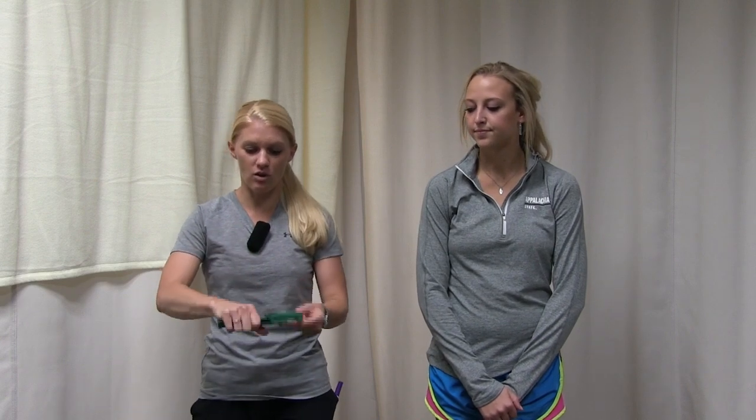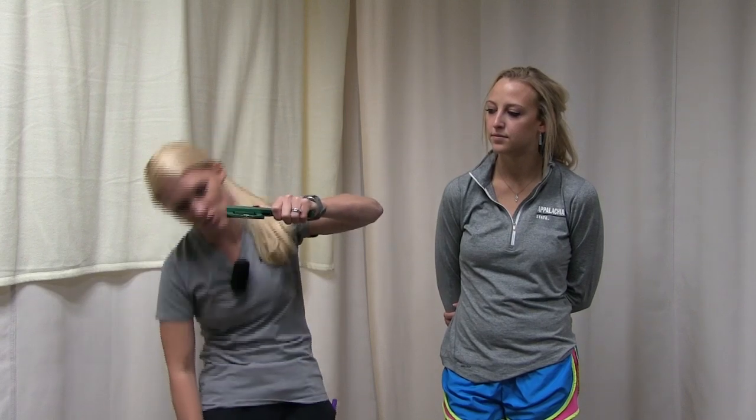These calipers are typically made for somebody who's right-handed, so you hold it with your thumb on the trigger and read the measurement. If you're left-handed it doesn't really work properly — you'd have to tilt your head underneath, so lefties just have to be a righty for the day. First, talk to your subject; most measurements are done under the shirt so we ask if they mind taking it off. It's possible to do measurements over clothing but you'll get skewed results.